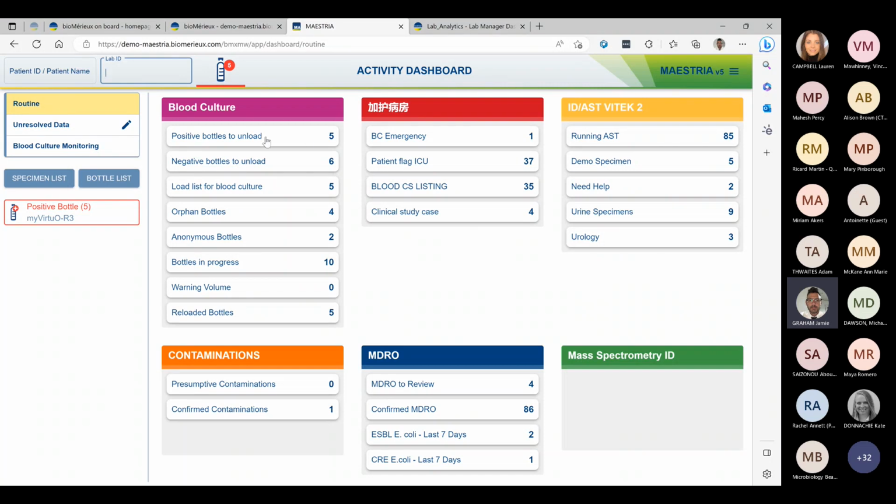And some of these lists, these activity lists, these buckets, some of these lists are kind of no-brainers. You would want certain activities to be pinned for review, but these are actually configured individually around each individual laboratory. So a good example of this is that we have this particular bucket, this particular bin in some sort of East Asian language. So this is one that probably my colleagues in another part of the world have configured, because we all have access. But they've been able to configure this, rename this particular list, and change the color as well.